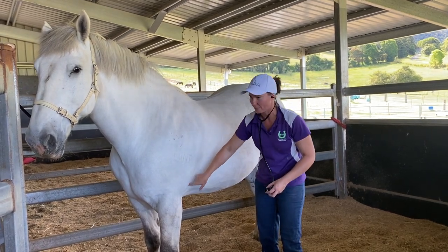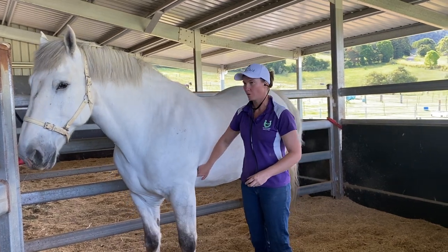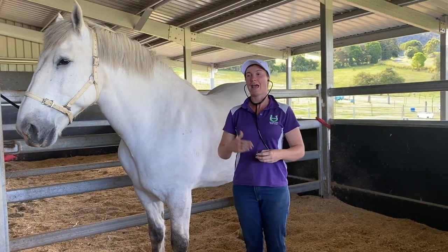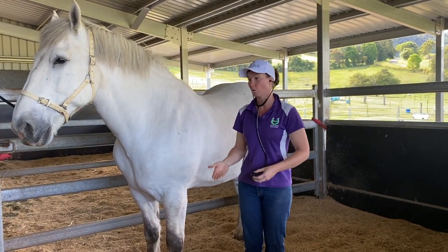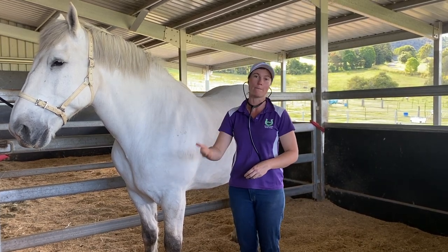And that's where the apex beat, the loudest part of your heart, will be, right here. You need to listen for either 15 seconds or 30 seconds, and then you can do some math to calculate how many beats per minute your horse has. The average horse's heart rate is between 24 and 44 beats per minute.